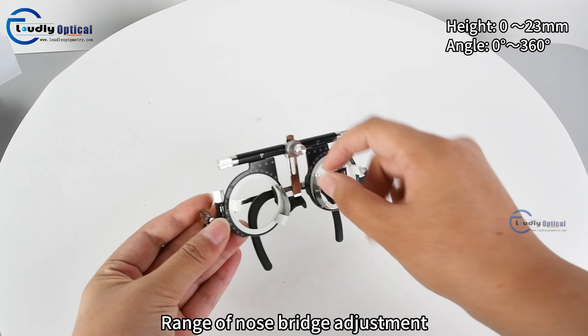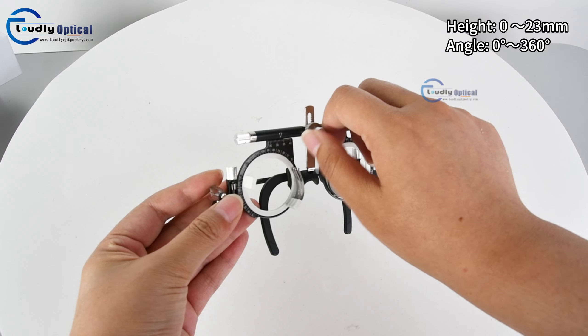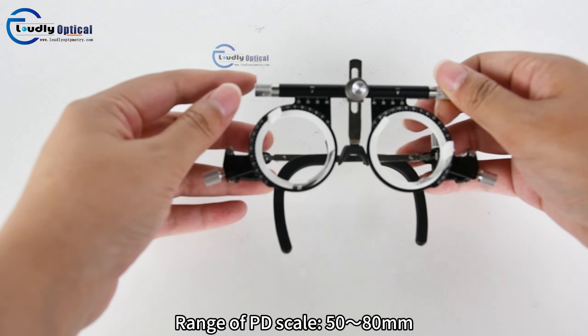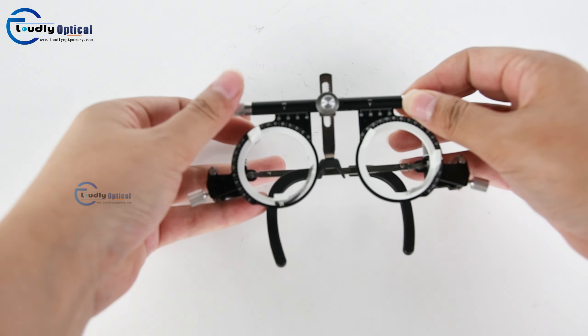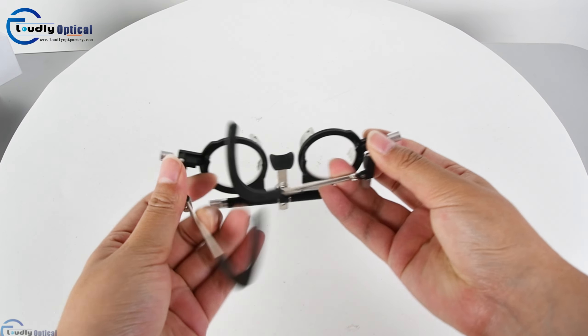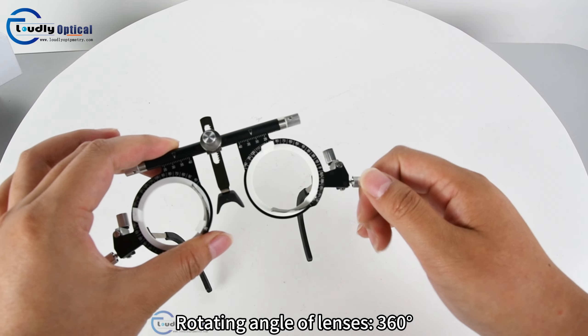Range of nose bridge adjustment. Range of PD scale 50-80 mm. Rotating angle of lenses: 360 degrees.